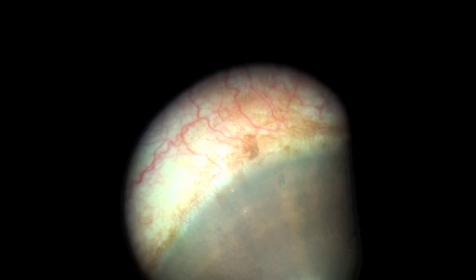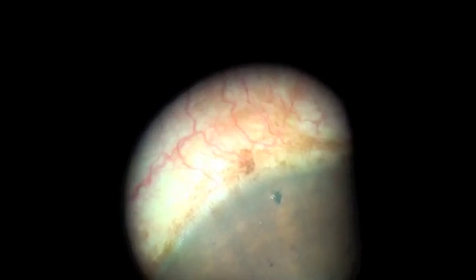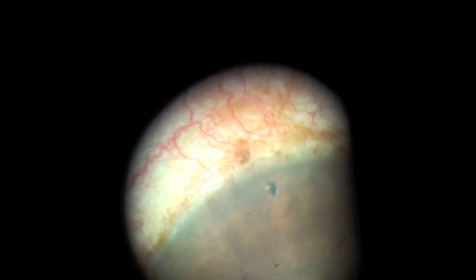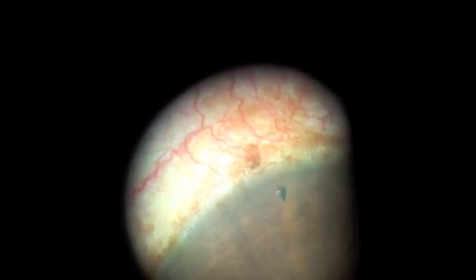We have a small crypt in the left eye, which is opened up with the first shot of the YAG laser. The same power settings are used — 3.2 millijoules.